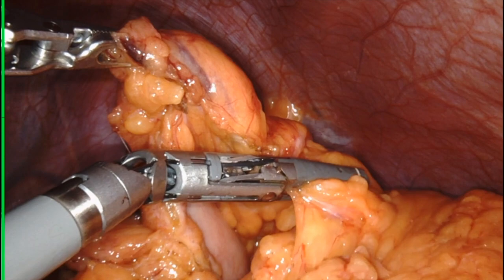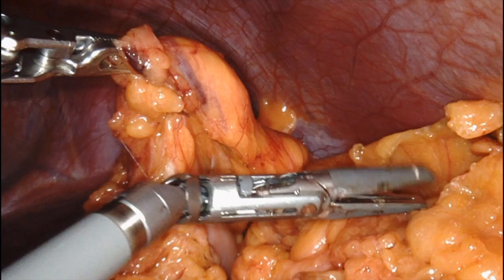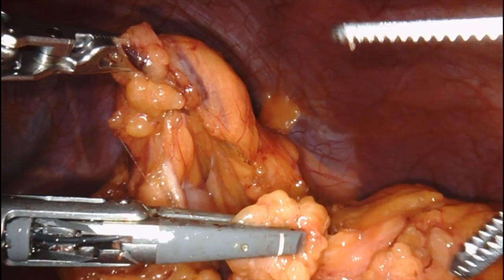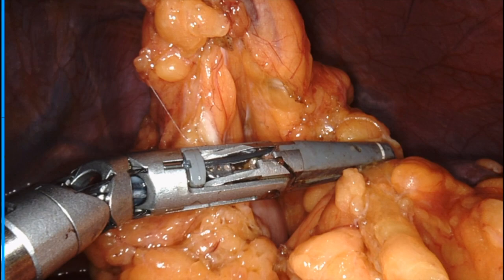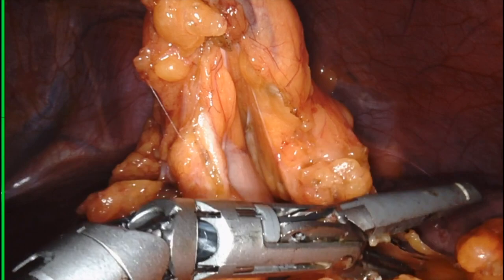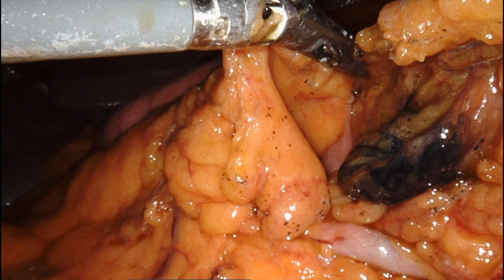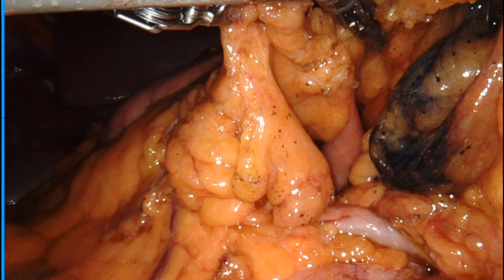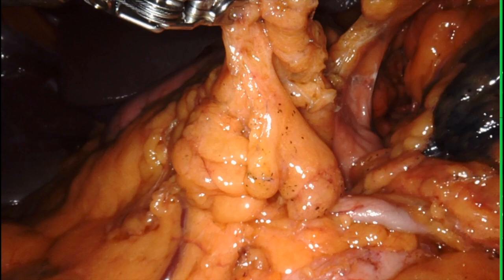There I'm starting to get closer to my dissection. I see another attachment of the omentum to the spleen and go ahead and take this with the vessel sealer. Once I'm satisfied with the dissection on top, I take the mesocolon — you can see there the angle of Treitz and the body of the pancreas — making sure I stay clear from the body of the pancreas and only taking the transverse mesocolon with my vessel sealer.